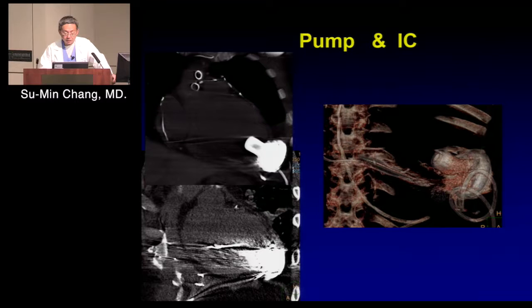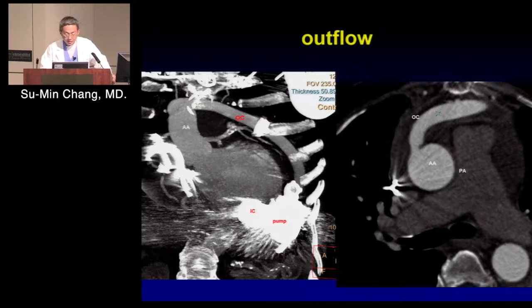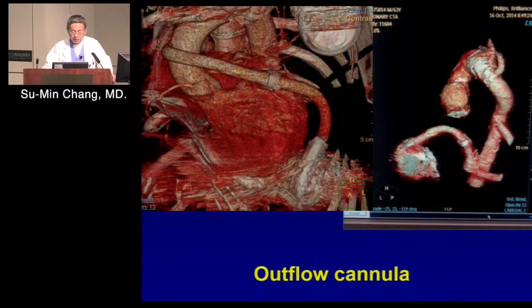And there's some algorithm we can use to decrease the artifact. And again, you can see the very different trajectory of the outflow cannula with this newer device, having the pump directly inserted into the apex. But then you get away with all this problem with the inflow cannula. Okay, so this is a 3D depiction of the HeartWare device. So I predict that with this type of device with a different trajectory of the outflow cannula, we might be seeing different sets of problems down the line.